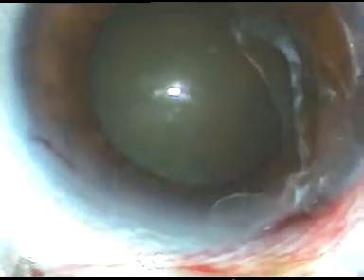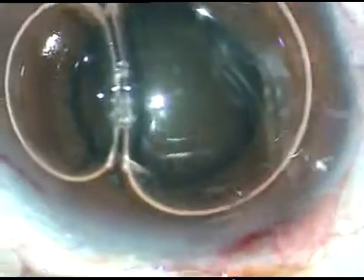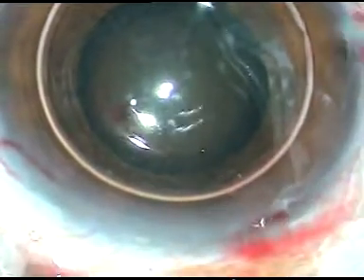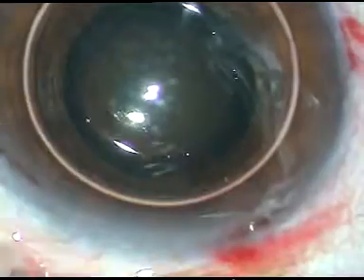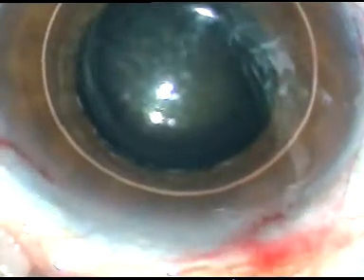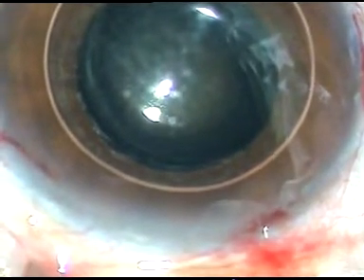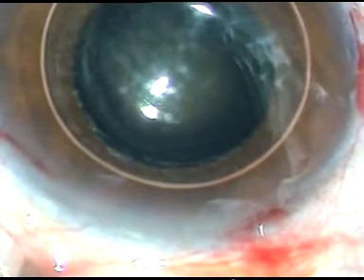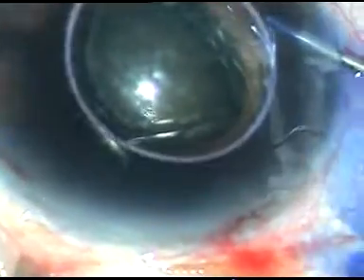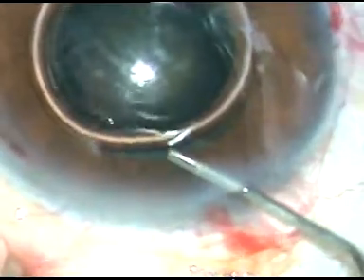By this time, I have made all the incisions. Now I am injecting an air bubble and I am going to stain the anterior capsule. Because if the pupil becomes small during surgery and if I have to use iris hooks, then the stained rhexis margin will be easy to identify. However, in this case, I am using adrenaline to see if the pupil remains dilated through the surgery.